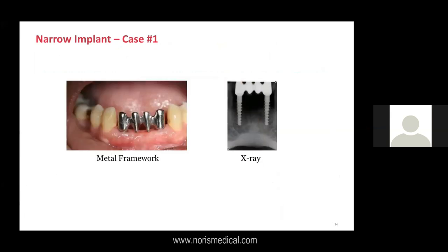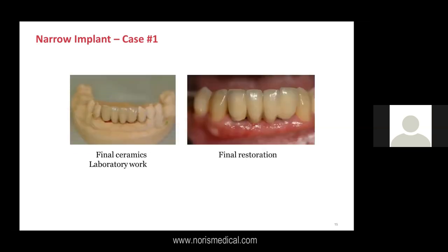Here you can see the metal frame, the X-ray, and this implant sits very good. When it sits very good, two, three, four, first year, usually it will last many years because there is no connection between implant and abutment.